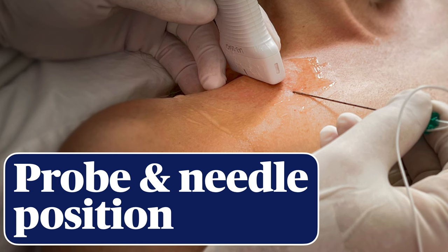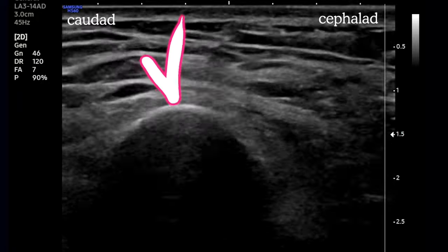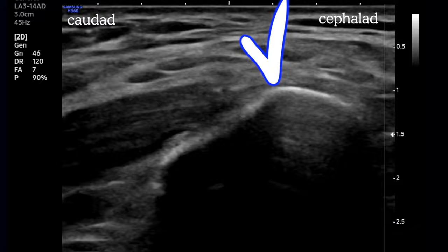To do this, we'll have the patient supine and a linear probe positioned over the clavicle in the sagittal orientation. The needle is advanced in-plane from the chest side. By gently scanning the clavicle, it's possible to precisely locate the fracture site and therefore know where to go on either side. Here we see the disruption of the bone cortex.